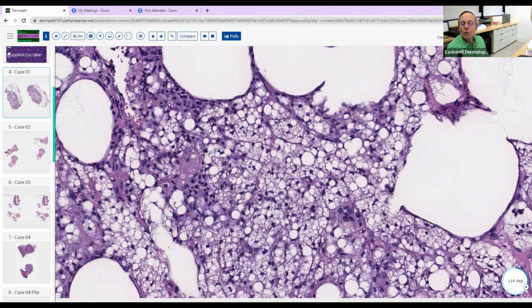What else can give you clear staining morphology in the skin? What's the differential diagnosis of that? That's something that when you read in textbooks and they talk about differential diagnoses, you're sort of talking about entities. They talk about squamous cell, basal cell, all those kind of things like neoplasms. But sometimes you need to look at the differential diagnosis of just one thing that's not necessarily an entity per se. So what's the differential diagnosis of things that give you clear staining cells in the skin?